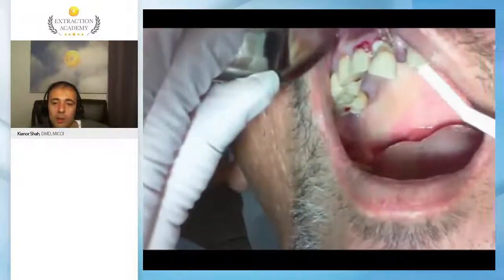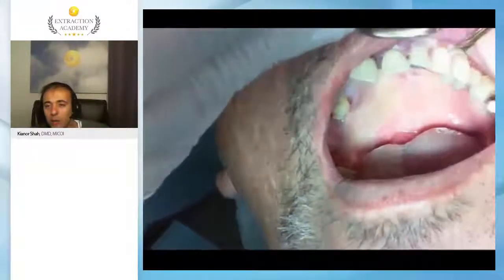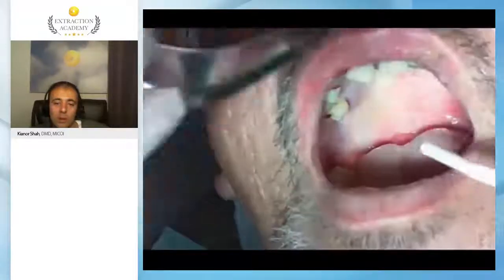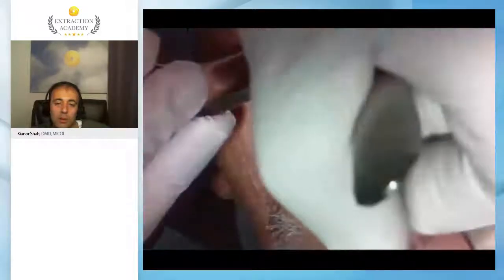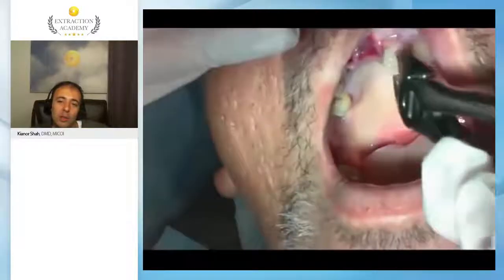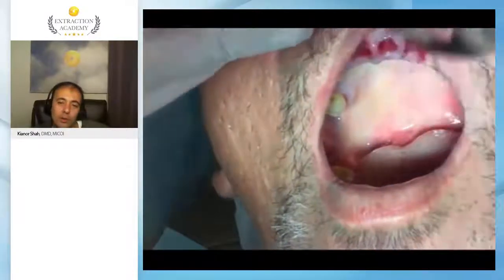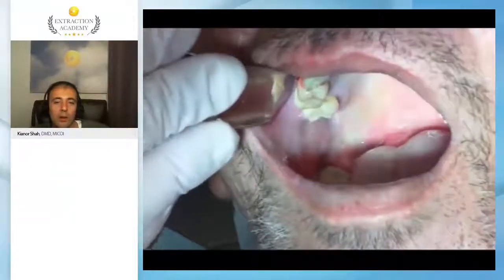The patient has quite a bit of periodontal involvement in the anteriors, but if you go back in and start using the adjacent teeth to elevate and create a nice scenario for us to go back and tackle the teeth one by one. So in periodontally compromised patients, you can simply use your rotational force, even sometimes in molars, very minute, just to get the pop. But certainly on the anteriors you can use this technique, and also on pedo patients, rotational movements come very handy. If you have a single rooted tooth, they're always an option.